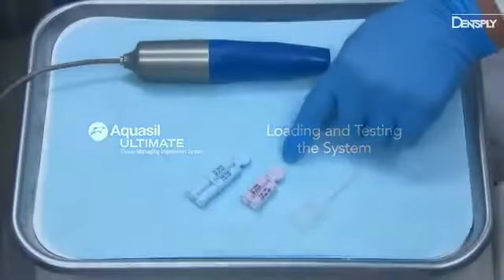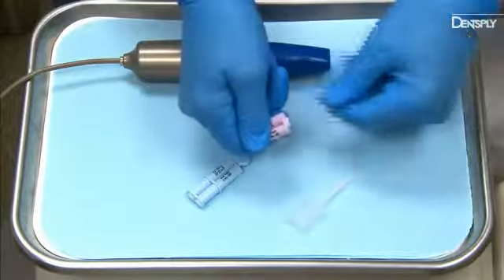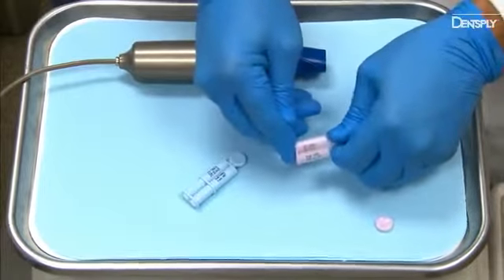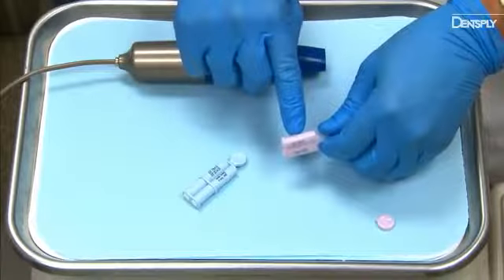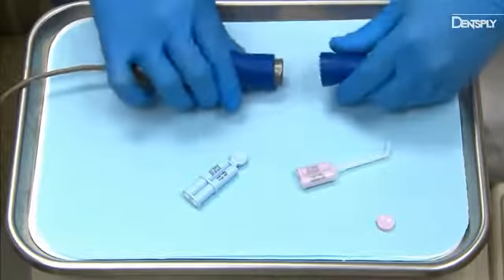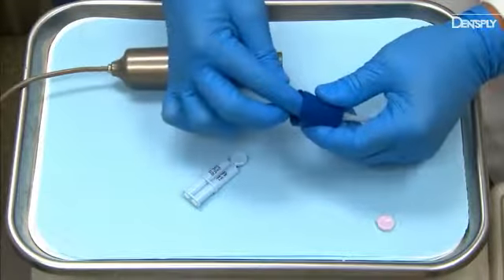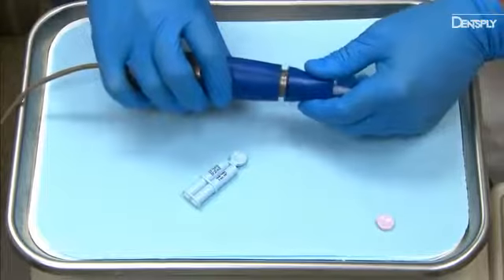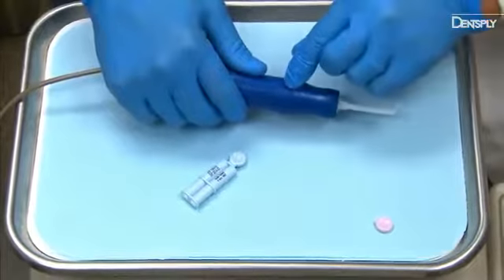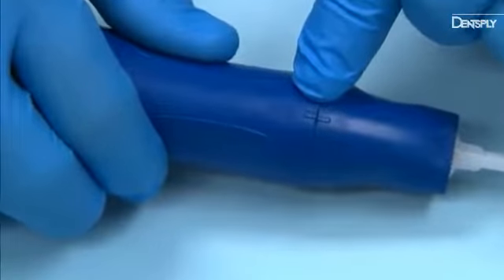To load the DigitPower Dispenser, choose a single or multi-unit cartridge. Snap off the circular disc and slide the cartridge into the mix tip, ensuring it is fully seated. Twist the dispenser cap counter-clockwise and remove the cap. Insert the cartridge with mix tip completely into the cap. Place the cap with the cartridge back onto the dispenser and twist clockwise to secure. Make sure the cap is completely seated with the notches on the cap and the grip aligned.